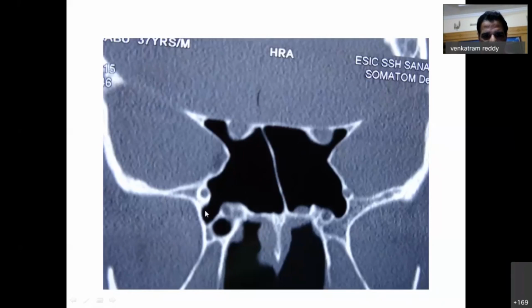And this is the lateral recess of the sphenoid. The lateral recess usually gets formed when there is a pneumatization of the pterygoid. When the pterygoid gets pneumatized, then you will find the lateral recess here. So this lateral recess of the sphenoid is very difficult to approach, and whenever there is any lesion in this lateral recess, especially in a case where there is a CSF leak in the lateral recess and in and around the vicinity of V2, you may have to drill this area, the pterygoid, and completely do a pterygoidectomy, and then go with the complete exposure of this lateral recess and the V2 area and the vidian and do your job adequately.